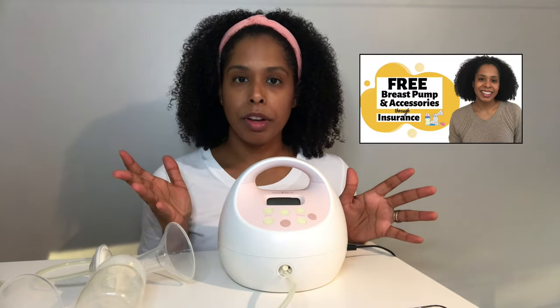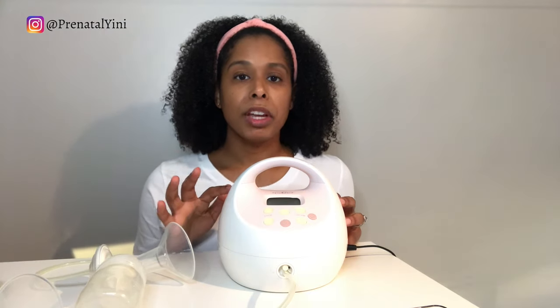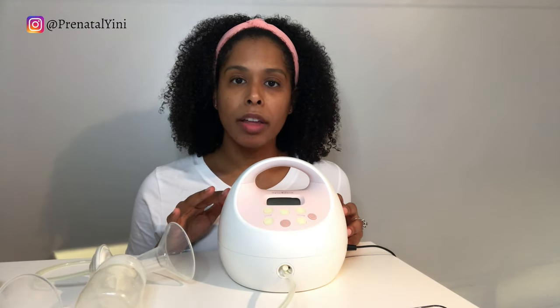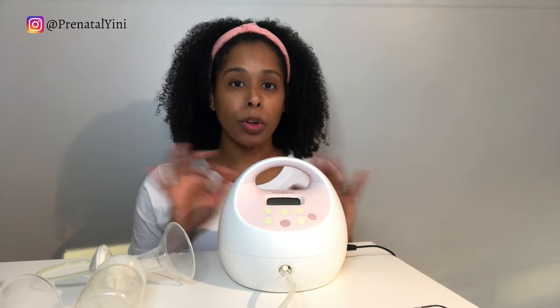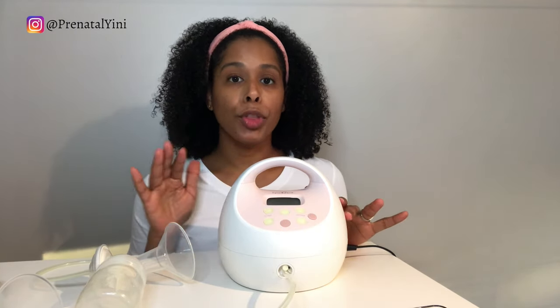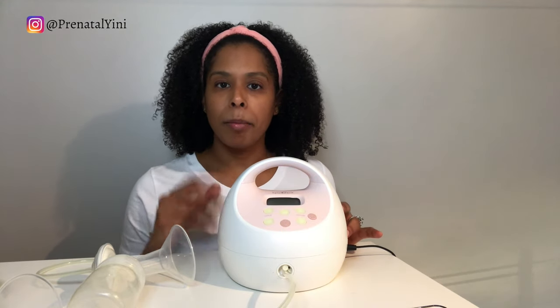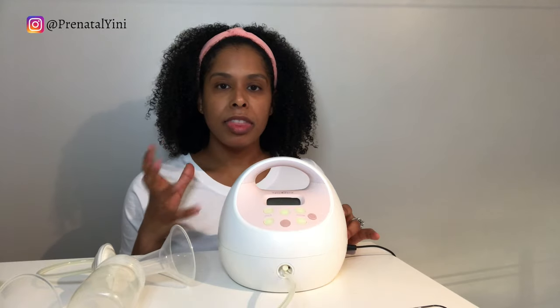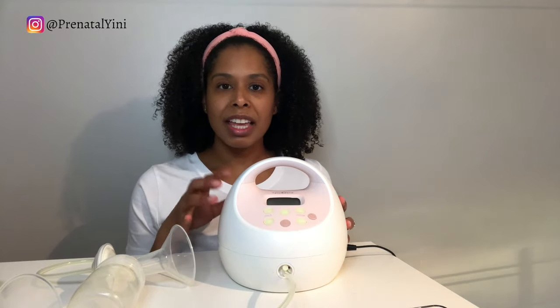They're widely available through insurance, have a good reputation, and a lot of moms recommend them. The Spectra S2 and S1 are equipped with a safety feature — the pump will automatically turn off after 30 minutes. They also have a two-phase expression mode that mimics a baby suckling at the breast, which helps in getting the most milk out.